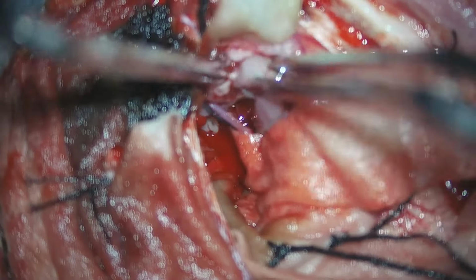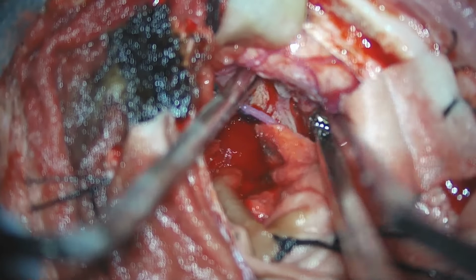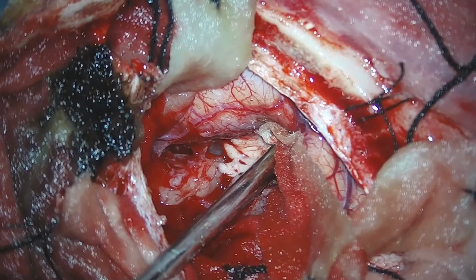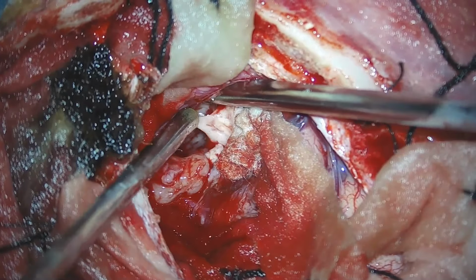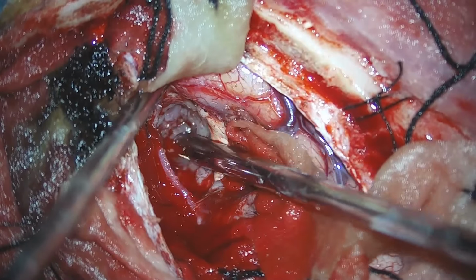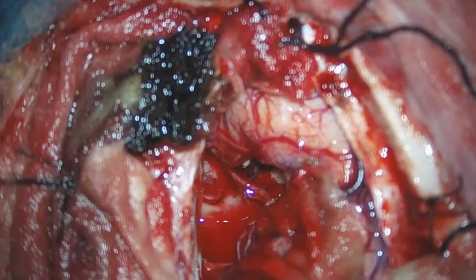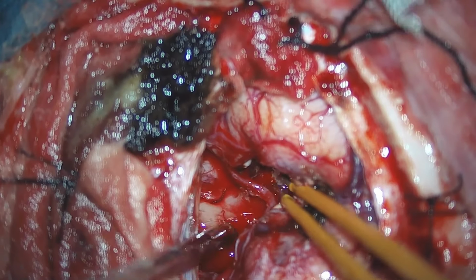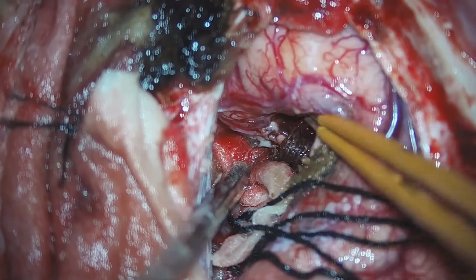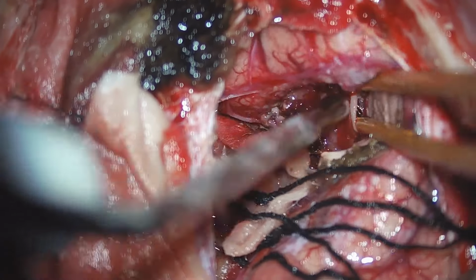We use the tumor holding forceps to slowly debulk it now. And later, we also use the debrider to debulk the tumor. Now we are using the debrider to slowly debulk the anterior pole of the tumor. You can see a good amount of debulking that is being carried out. Once that is done, we again see that there is no active bleeding coming from the tumor bed or the normal brain area, and all the veins and arteries are preserved.